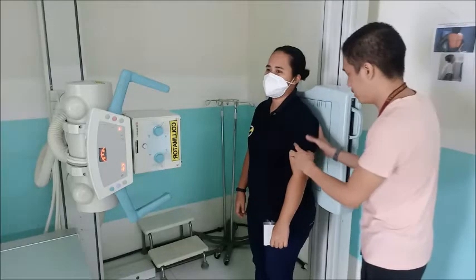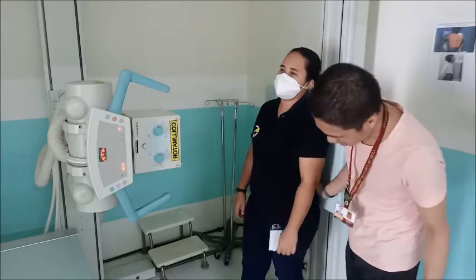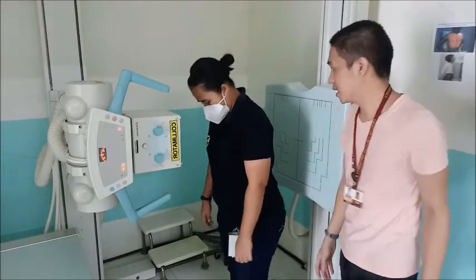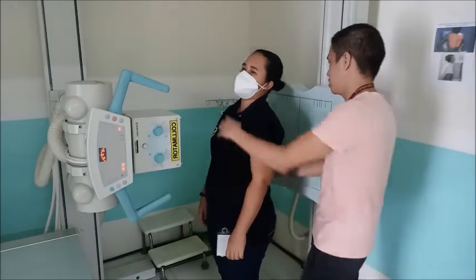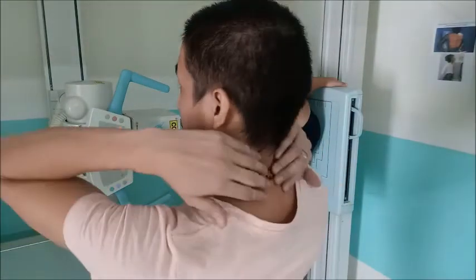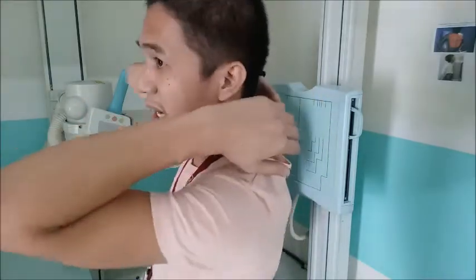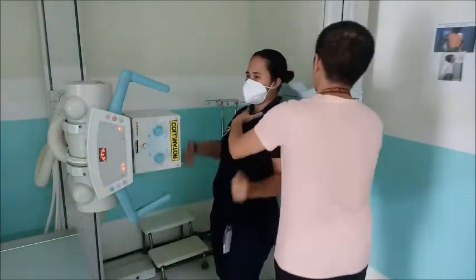Okay? So for the apicolordotic view, patindog si patient, stand straight, and then take one step forward. So one step forward atong patient, and then tilt the body of the patient, and then ask the patient nga ang likod sa iyang liog should be placed in contact with the IR. So at the same time, ang liog niya placed in contact with the chest bucky. So ang shoulder po sa niya is naka-place in contact dito. Okay.